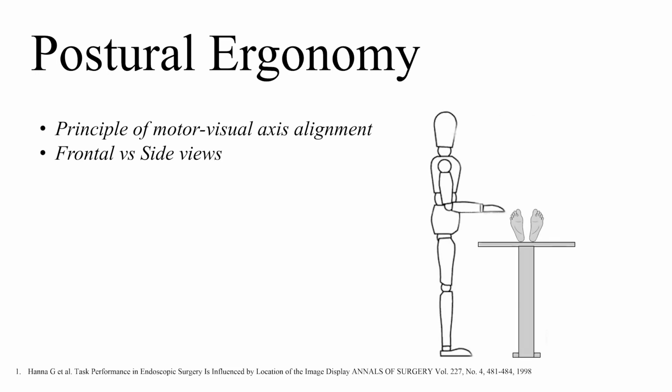Also, when in frontal view, hand-level, gaze-down viewing resulted again in shorter times and increased performance scores when compared with the eye-level frontal view alone.